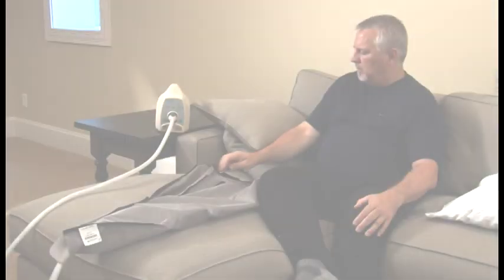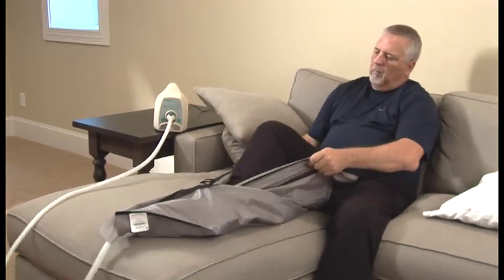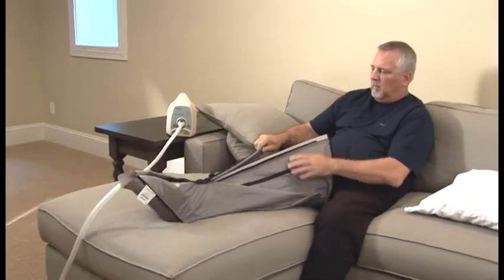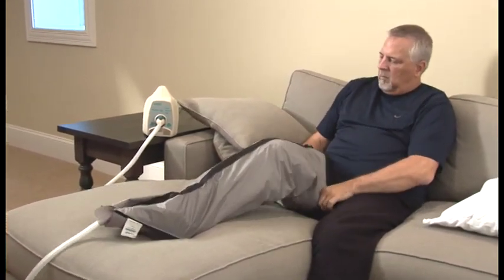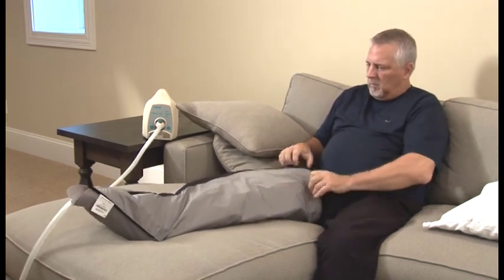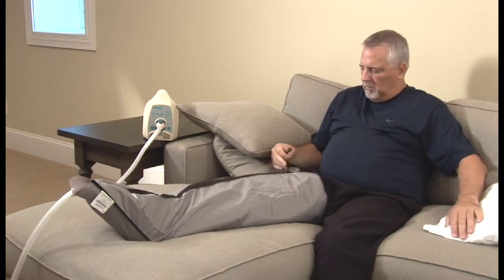Applying the garment is easy. If you are using a leg garment, sit down and slide your affected leg into the open end of the garment, which is the side opposite from where the air hose exits the garment. Position your foot so the garment is pulled up to the top of your thigh for a full leg garment, or to the knee for a half leg garment. Ensure that your toes remain fully enclosed within the garment, then zip the garment closed.